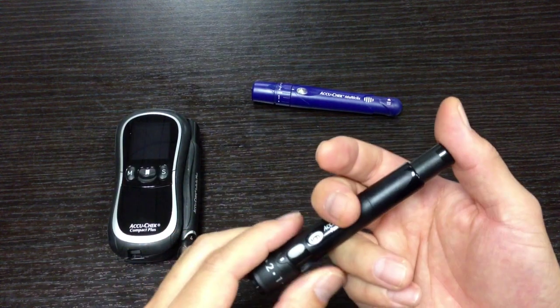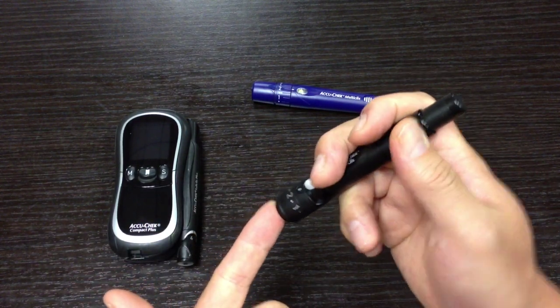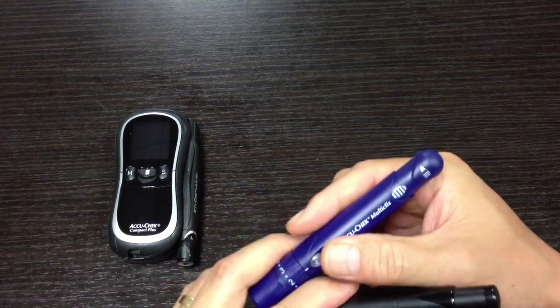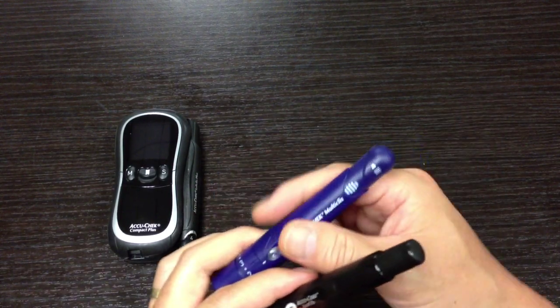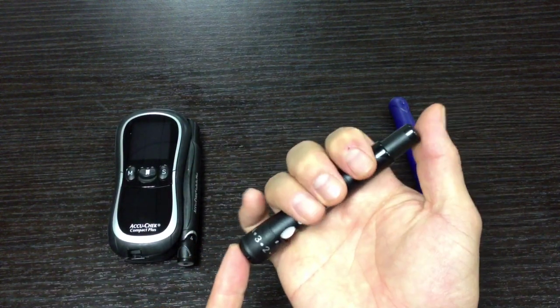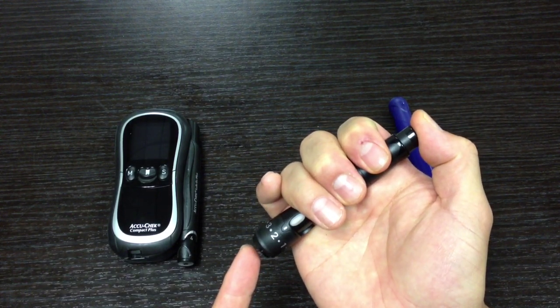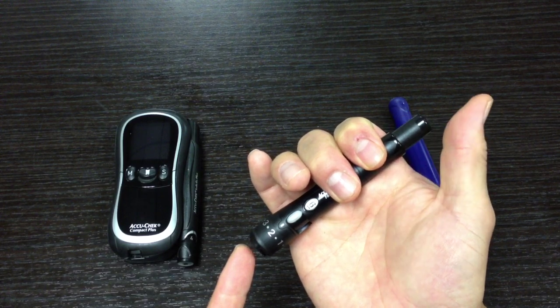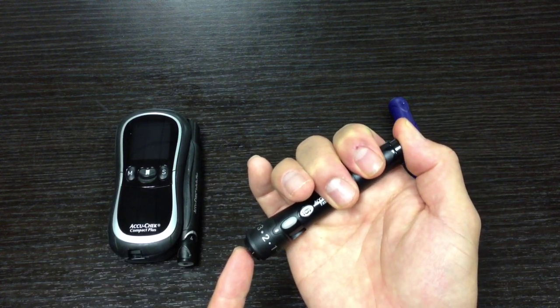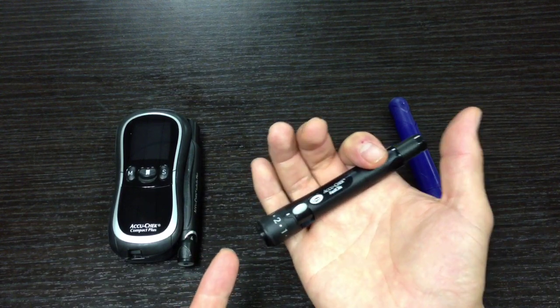This is the part I really like: when you put it on your finger, whereas the old one required you to engage it and then press the button — two steps — this one is pretty unique. All you do is put it on your finger and press the back just like a ballpoint pen. When you press it you can hear it — that's it. It engages and pricks your finger at the same time. So much easier — instead of two steps, there's one step.